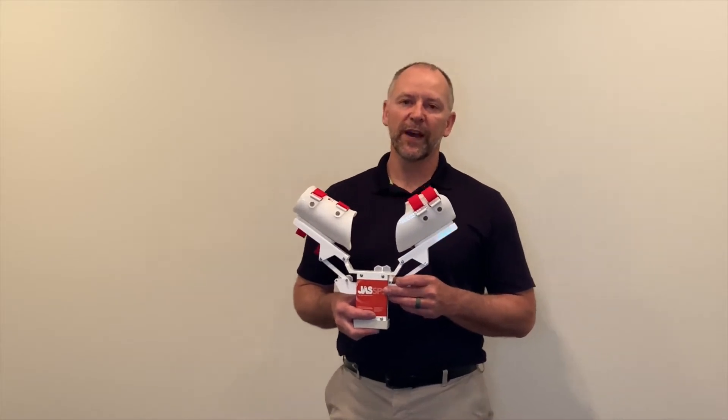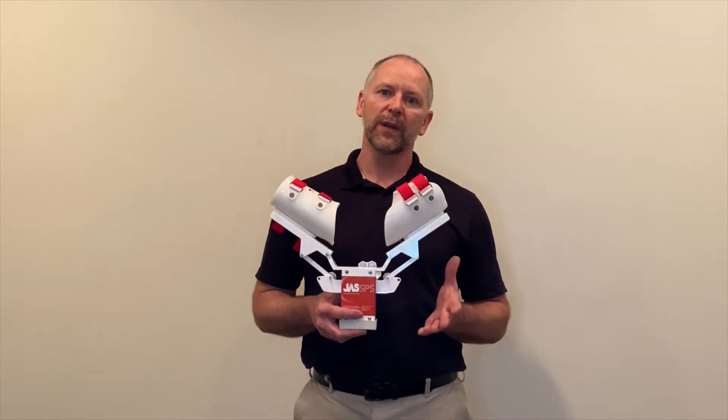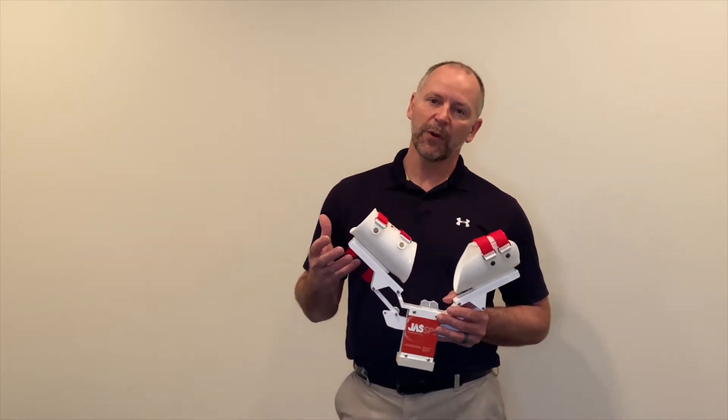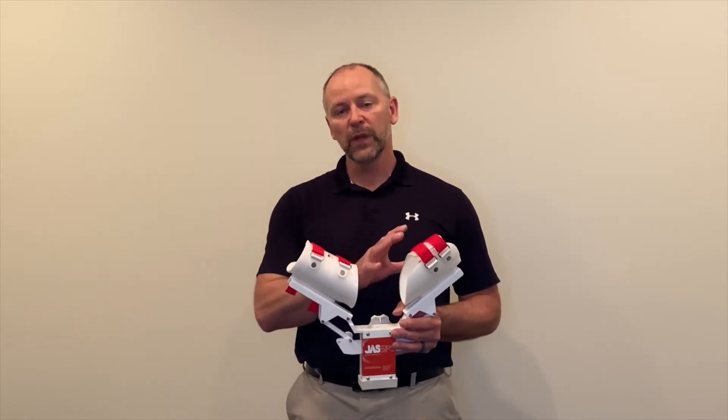Hi, I'm Brian King, Certified Orthotist and Prosthetist here at Joint Active Systems. In this video, we're going to review how to take proper length measurements when ordering and fitting a jazz elbow range of motion device. It's really important to capture proper length measurements so that we're maximizing our lever arms above and below the affected joint without creating fitting complications for the patient.